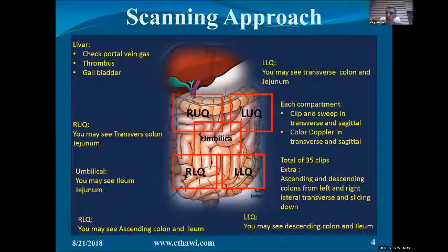When you see air, you will see reverberation, the mirror imaging, and maybe you see comet tail artifacts. So when you see air, you have to do one of two things: either press more if the baby is okay and not sick, or turn the baby, or move away from the umbilicus. It depends on whatever you want to do.